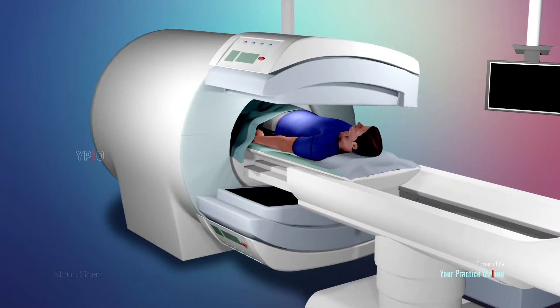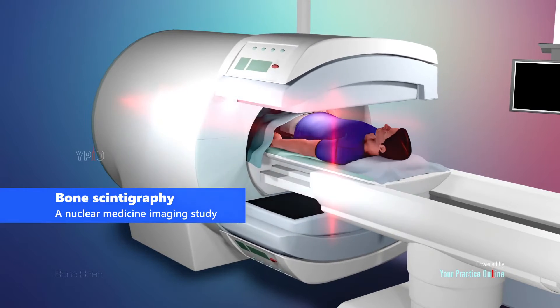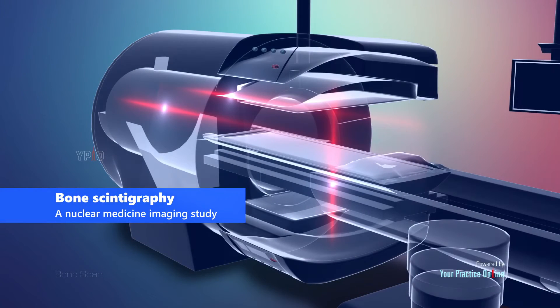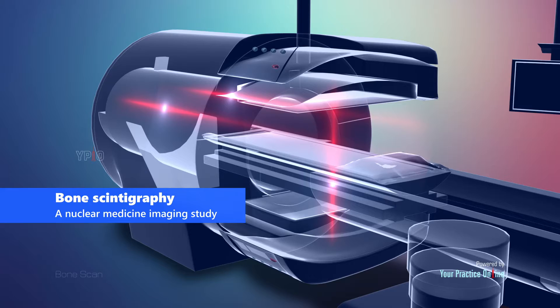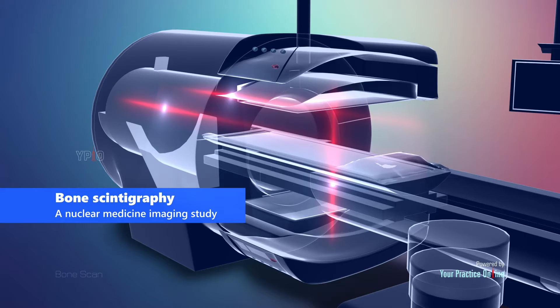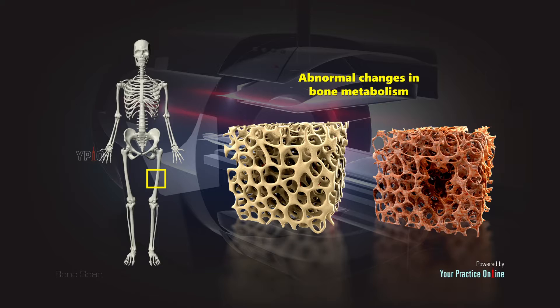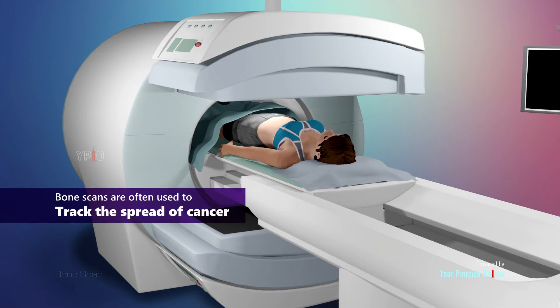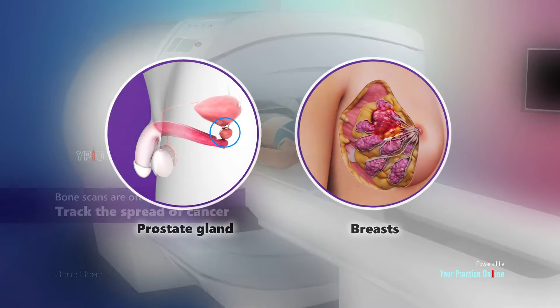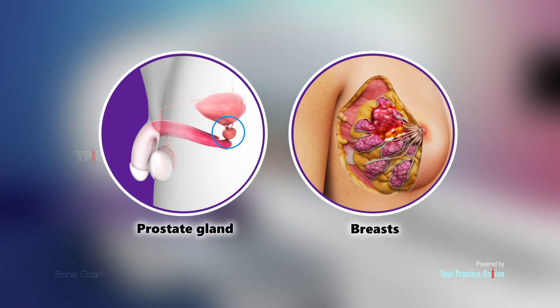A bone scan, also known as bone scintigraphy, is a nuclear medicine imaging study that involves the use of radioactive tracers to help diagnose various kinds of bone disease by detecting abnormal changes in bone metabolism. Bone scans are often used to track the spread of cancer from other parts of the body, such as the prostate gland or breasts, to the bone and assess the response to treatment.